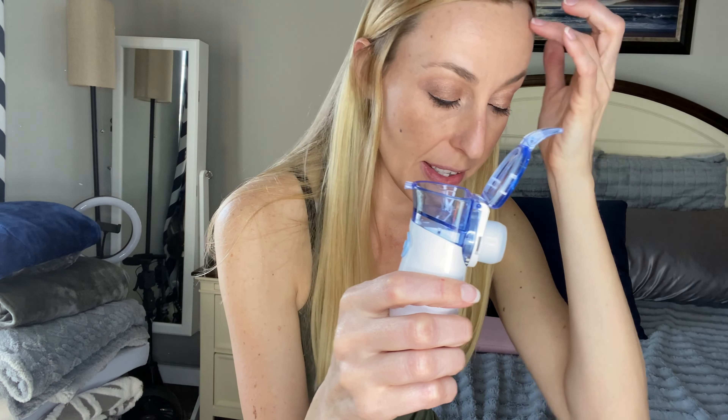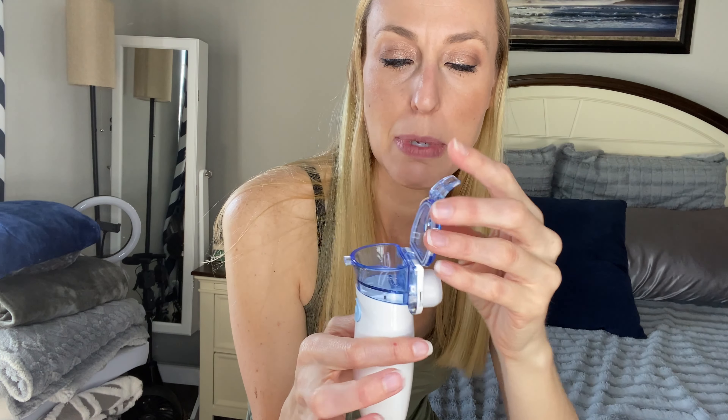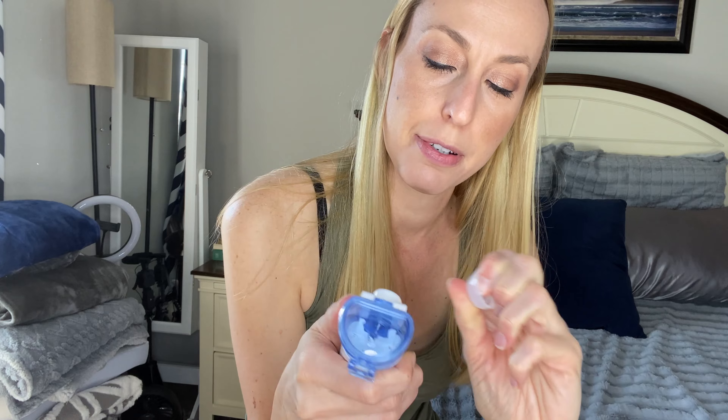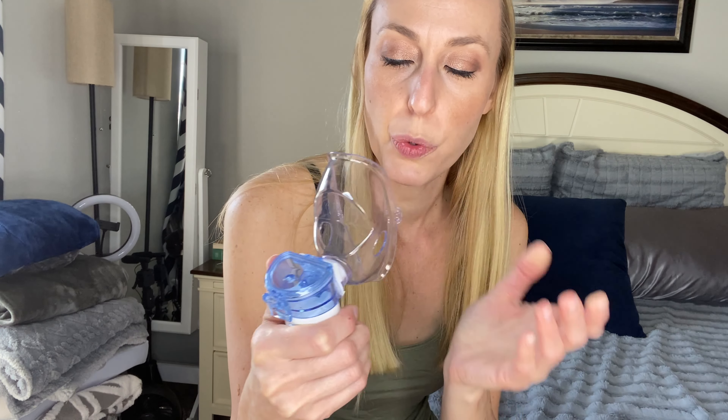Then this part opens up, and this is where you can put in your medical drops, whatever kind of medicine you might be needing to take. You'll close that up, and then you take this part off, and you apply whichever of the mouthpieces that you need to or want to, right onto there.